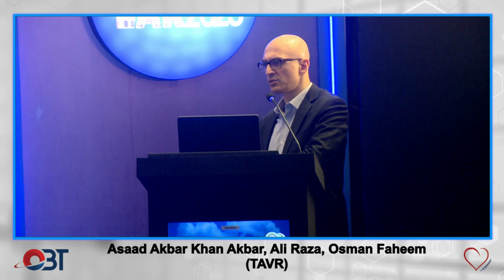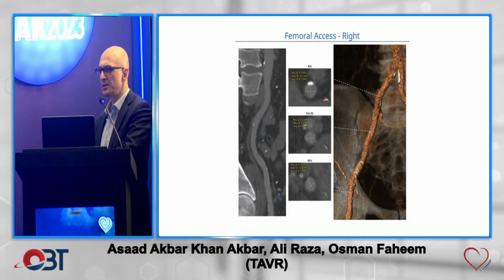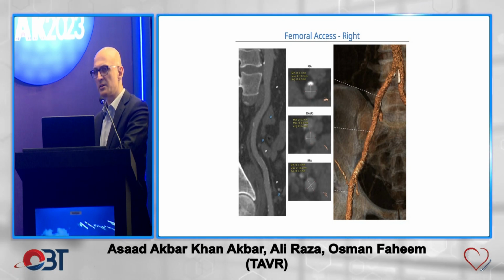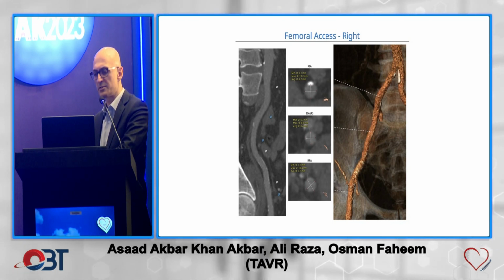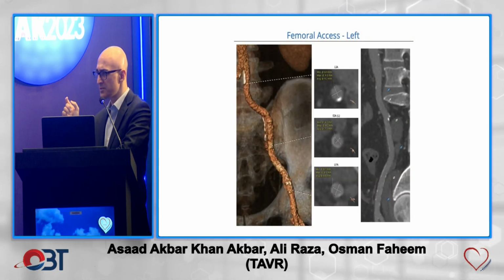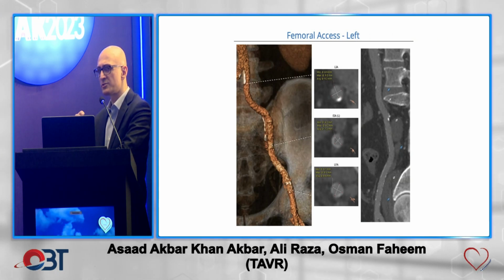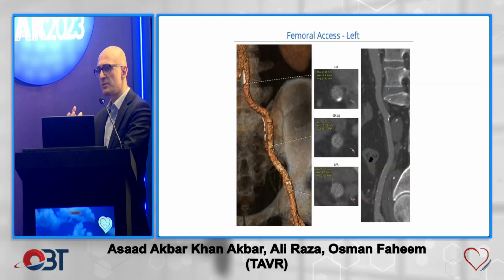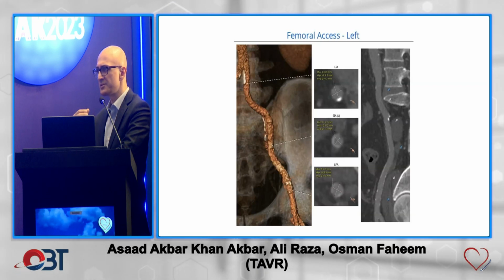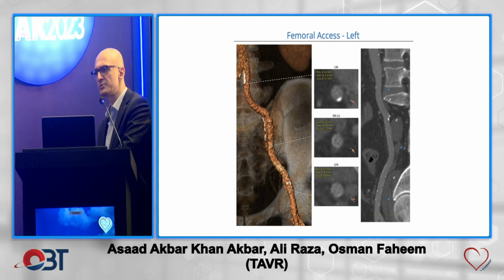So we could move on to the access, and this patient's access was very good. You know, those days are long gone of iliac on a stick and all of that stuff. We've seen those slides. Now, generally, we're pretty aggressive about going through smaller and smaller vessels, and what you're going to look at is not just the vessel size, but the calcium, the distribution of calcium, and how circumferential it is. You could have a large enough vessel with circumferential 360-degree iliac or distal aorta calcium and run into issues.